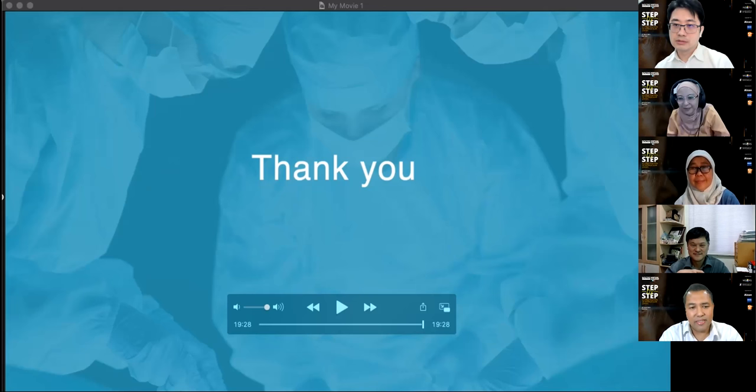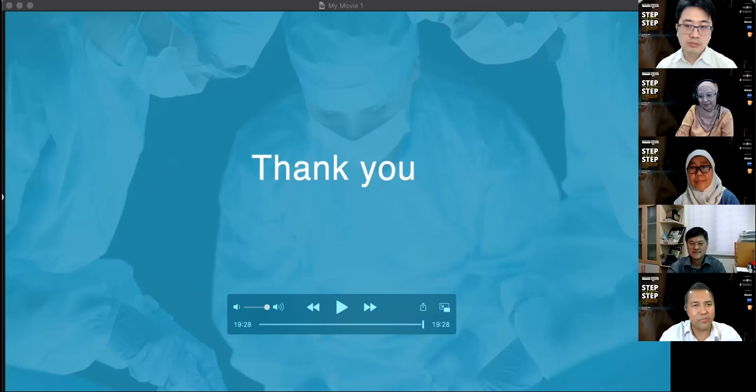Yeah, I mean it is. That's why when I went to other places, I will actually ask for that. What do you have? If, let's say, you have a retinal one, then I know what needs to be done. If not, that's where the trailing haptic came in. When you actually have that long thing to come in, it's very difficult, at least for me.